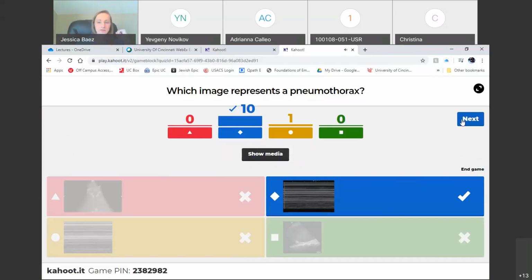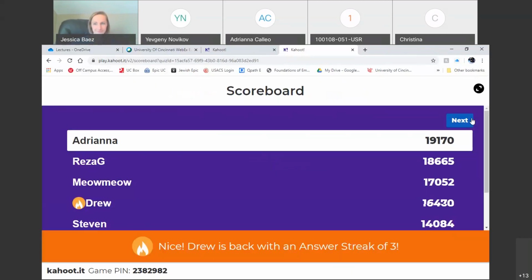Nice. So this one, you're looking for the barcode sign. I know it's kind of challenging to see probably since these images are so tiny, but this is a barcode in contrast to this one, which is kind of a sandy beach. You can see the little squiggles in the far field over there. Nice.